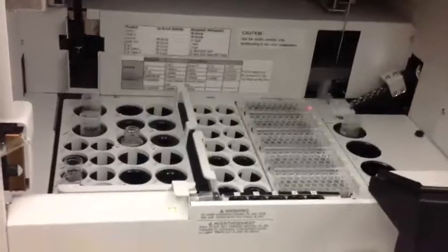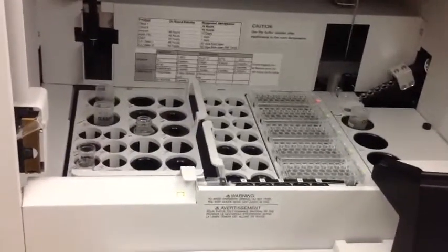This is our coagulation analyzer. We have two of them over here. You can take a look inside. This is where we do ProTime, and we also do PTT testing. This is to see if a patient has a blood clotting disorder or if they've taken too much of the blood thinners.